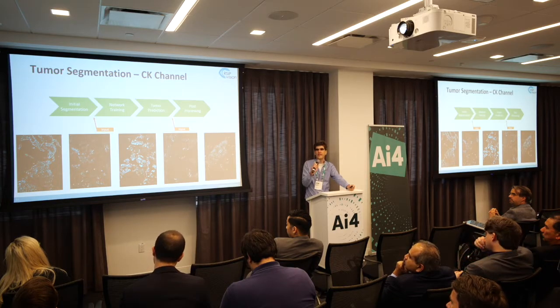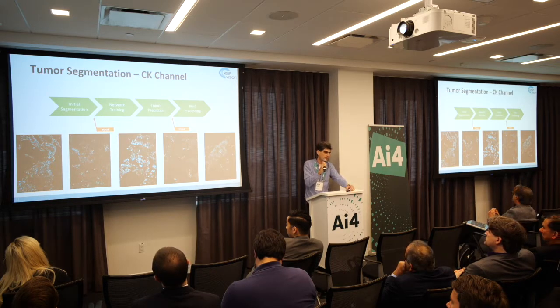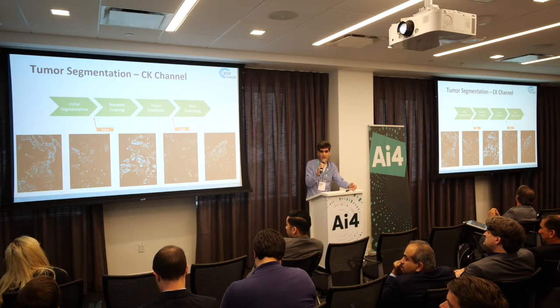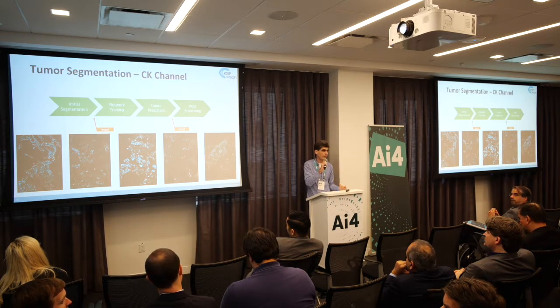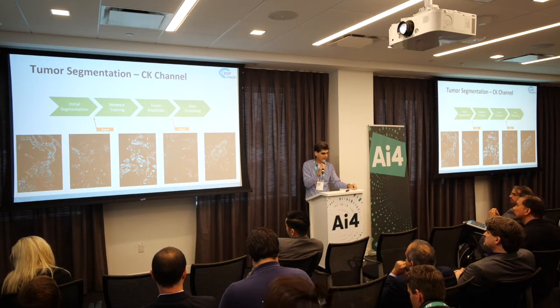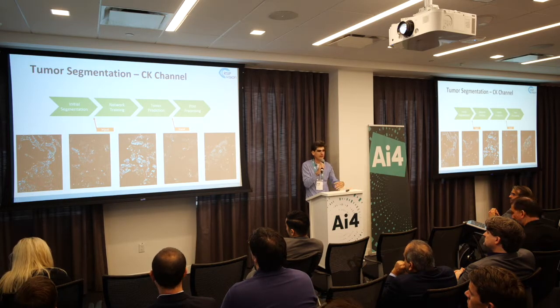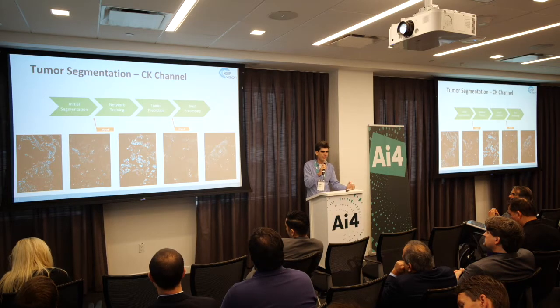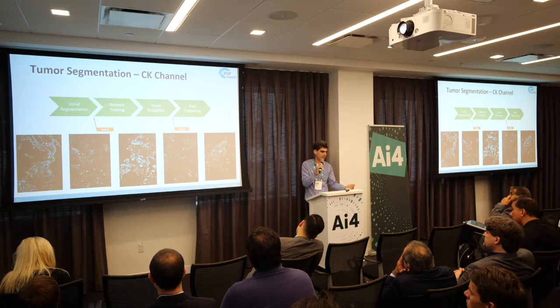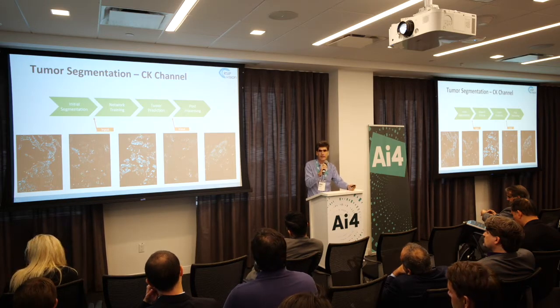What's interesting here is how to get the data annotated and how much data you need annotated. Because if you don't have enough slides, then the network's not going to learn. It still takes a lot of annotation. And again, here, classical algorithms are actually your friend because you can hand tweak locally the classical algorithms to get a decent result. You can correct that. You don't even have to be too obsessive about correcting it perfectly in all areas, because what we find is that after you take this even noisy training data and feed it into a neural network, the network's going to generalize better than the noisy training data.